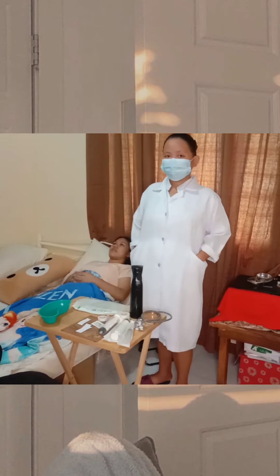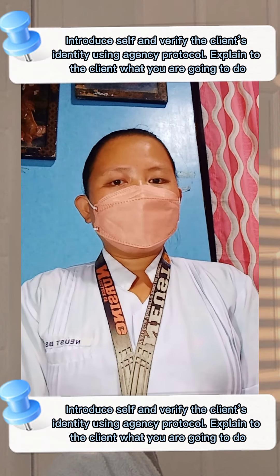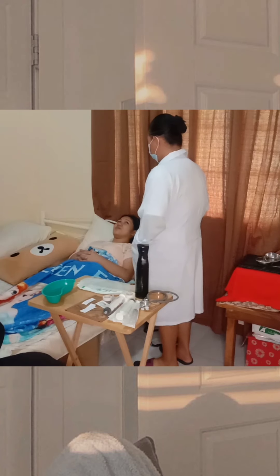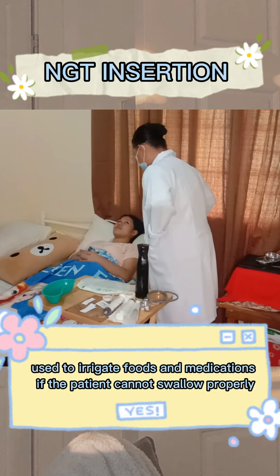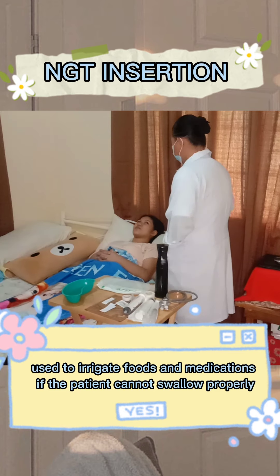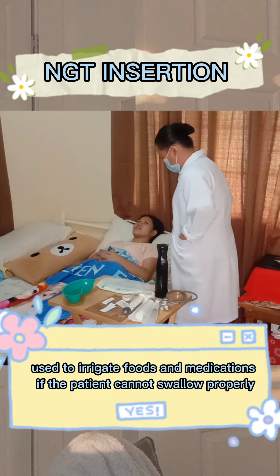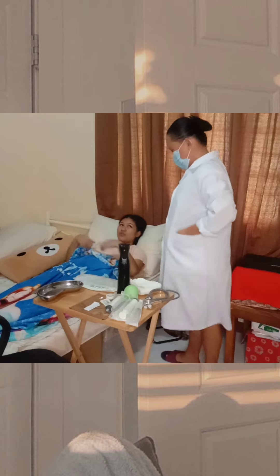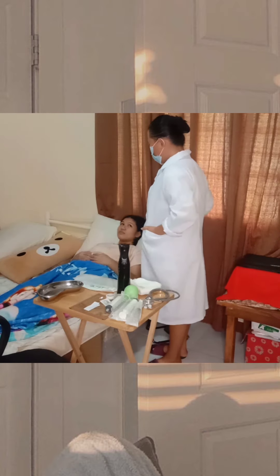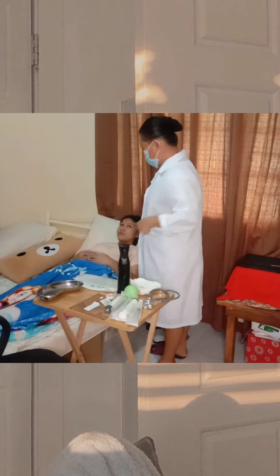For the implementation of the procedure, the first step is to introduce yourself and verify the client's identity using agency protocol. Explain to the client what you are going to do: 'Ma'am, this procedure is called nasogastric tube insertion. We are inserting a tube in your body to administer food, medication, and other nutrients that your body will need. I am Joanna Ivey Amoramos from BSN3 Black. I am your student nurse for today and the rest of my duty hours. If you have questions, don't hesitate to ask me.'